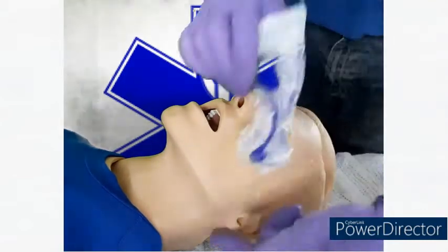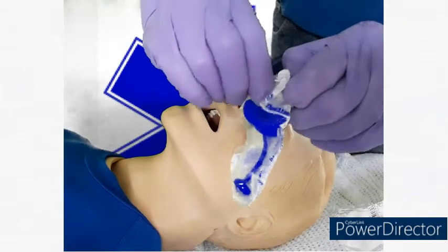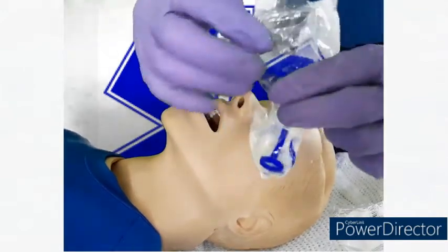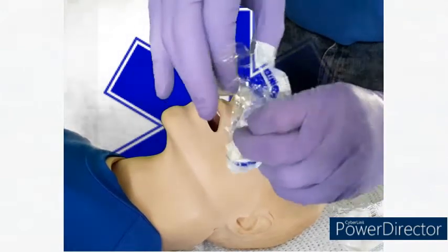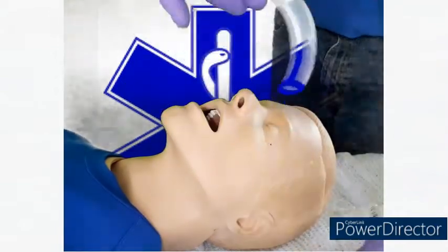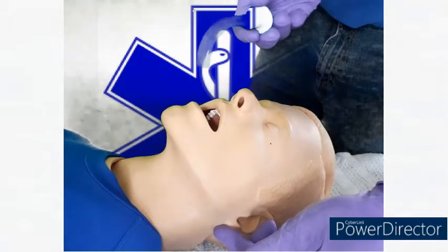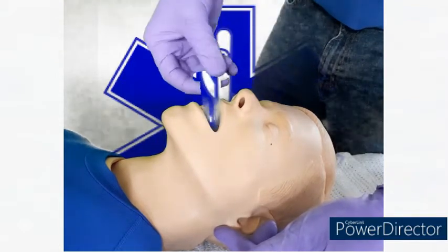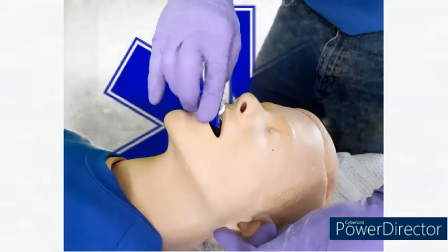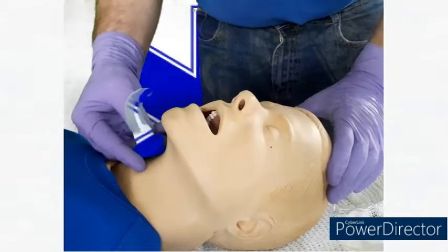Once I've measured, keeping it round the correct way, I can open the oropharyngeal airway and just pinch the top, so I'm not touching the whole of it. I remove it from its packaging, I then invert it, insert it, rotate it, locate it. If they gag on this, it will roll out forwards.